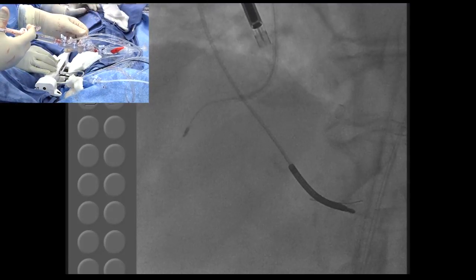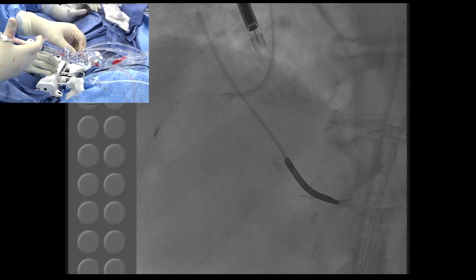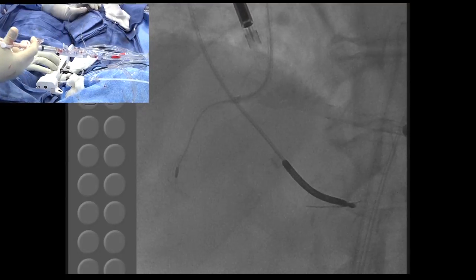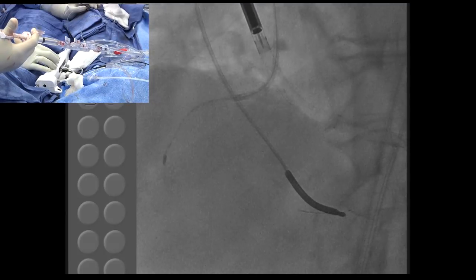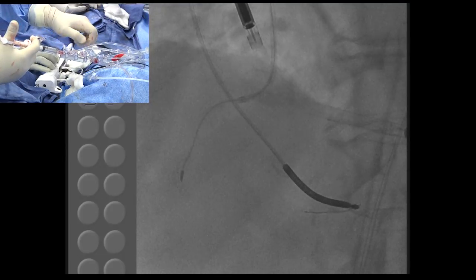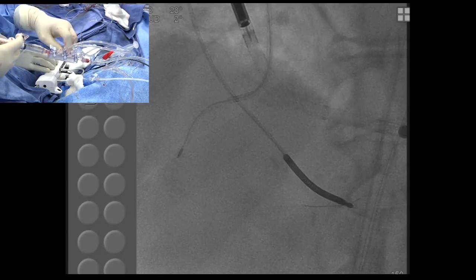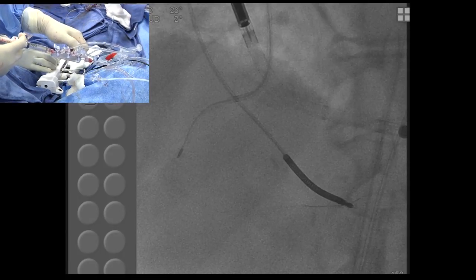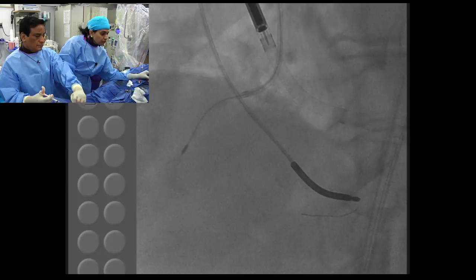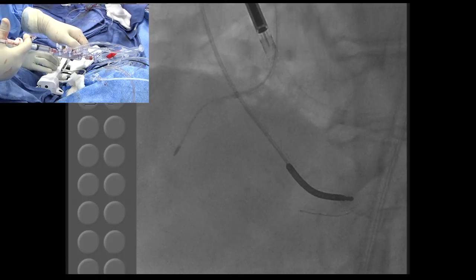Go a little more on the speed, guys. Go to 140 at least. As soon as you are reaching the lesion, there's a drop in the RPM. Good. 41, 20 seconds. And 20 seconds is our limit. You wait and then go back again. Go a little higher speed. We need to go maybe 150 plus. Yeah, go to 150, a little higher. Good.